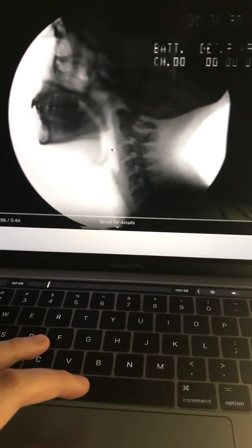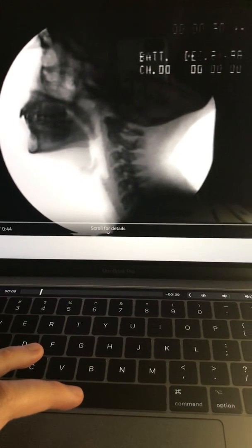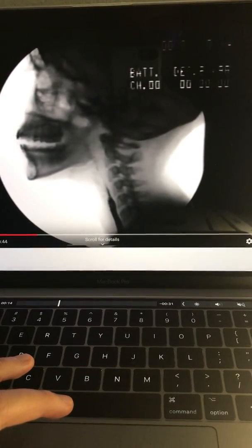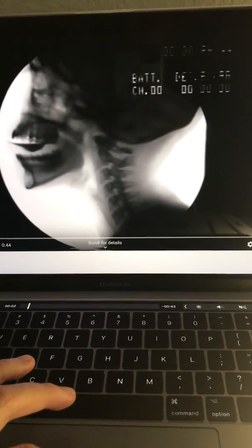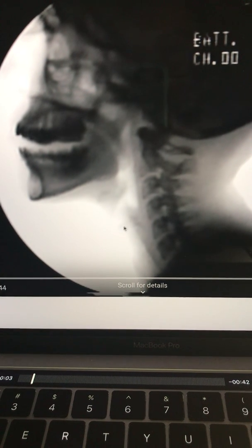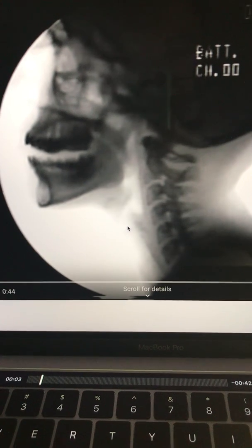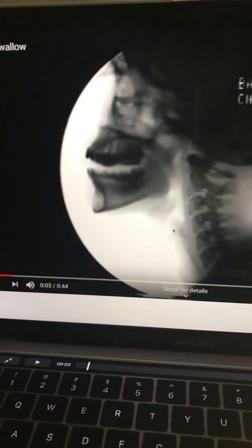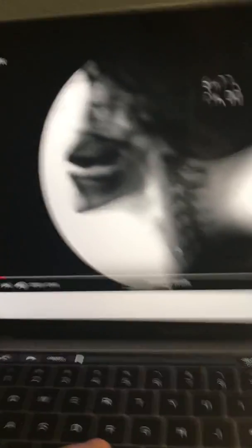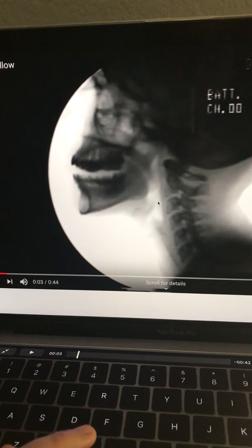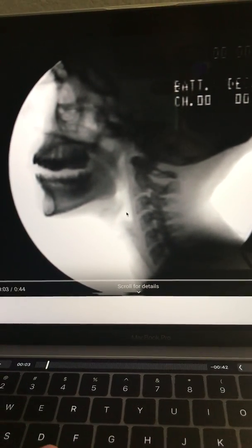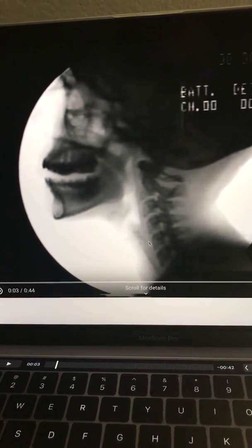Between the base of the tongue and the epiglottis, this space right here is the valleculae. Moving down into the laryngopharynx, this white space right here is where the vocal folds are going to be. I showed you the epiglottis here, and then the esophagus is back here. The UES is going to open right here where the piriform sinus is. Once the swallow is initiated, the epiglottis is gonna come down, the UES is gonna open, and the food is gonna go down the esophagus.